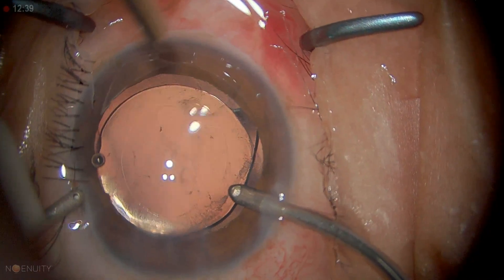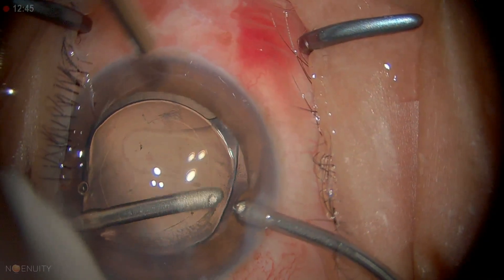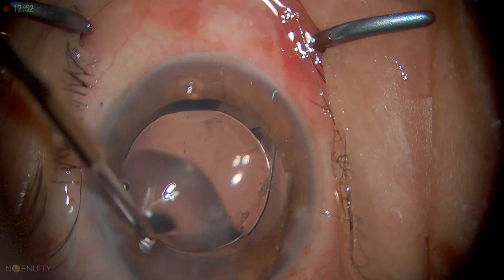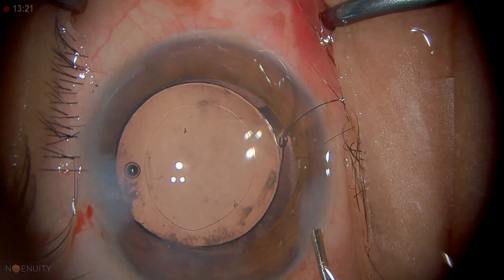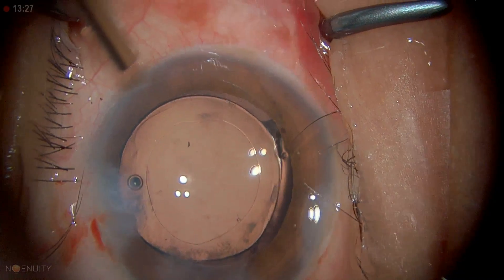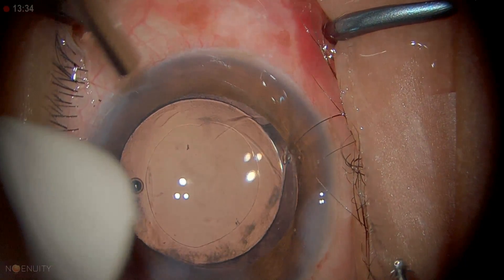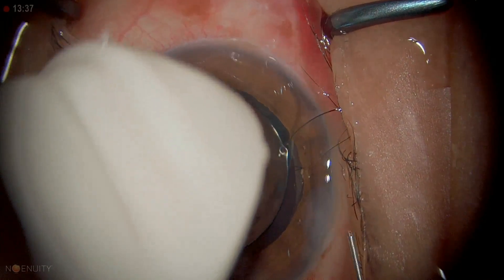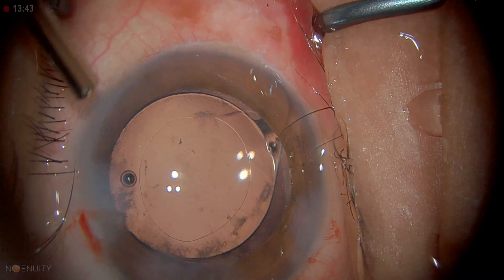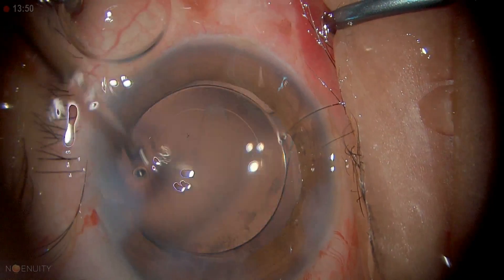Always go in with the infusion first, and then take the other instrument out. We'll just clean up the subcapsular area a little bit — it's always nice to have a clean capsule. Visualization of the retina is better when the capsule is polished. It's always good to over-inflate it a little bit, but remember at the end you need to tap it so that the intraocular pressure is not high, because that causes two problems: it causes pain to the patient postoperatively as the block wears off, and it will endanger the optic nerve. The last part is to give some intracameral Vigamox, which I always do, and some on the cornea as well.